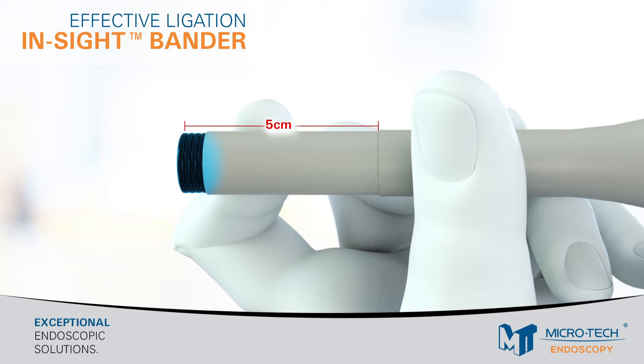If desired, the depth indicator groove on the barrel of the device can be used for blind ligation after the anoscope is withdrawn.